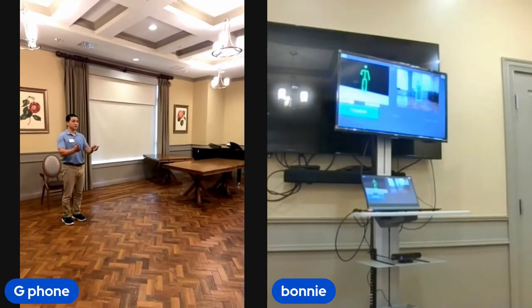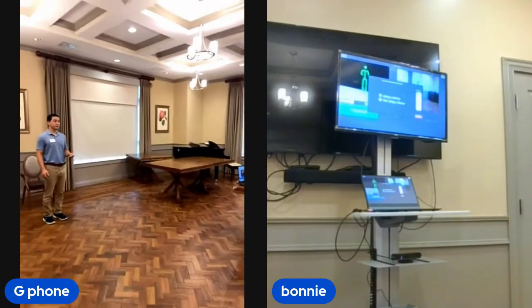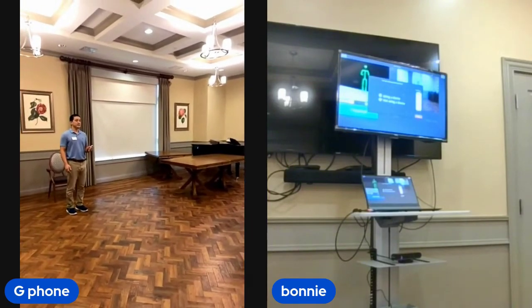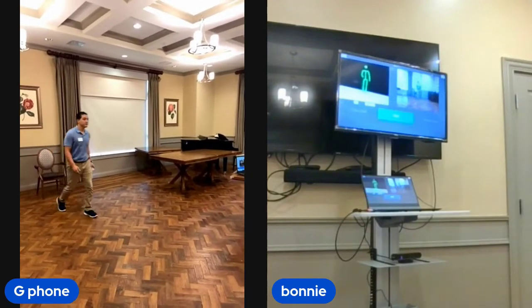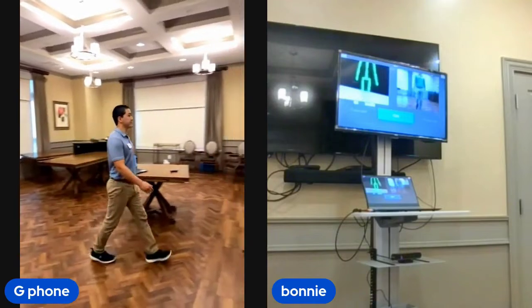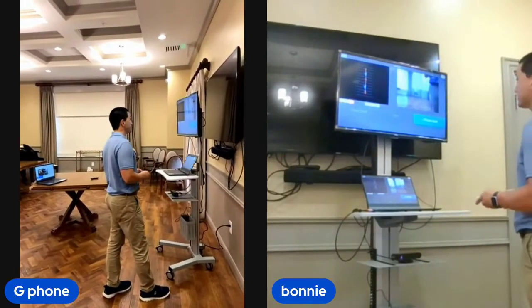And then I'm just walking towards the screen. Asking if we're using a device. You can use just the standard walker. There we go. Unlock. Test completed. Press next to finish the test. Okay.